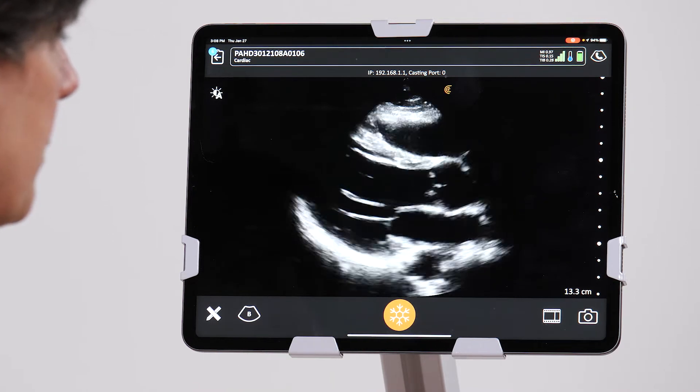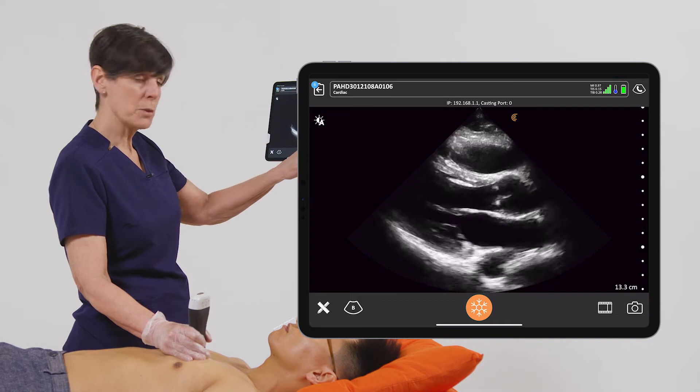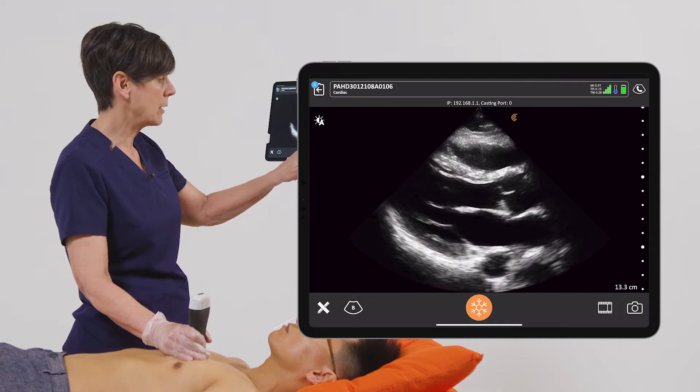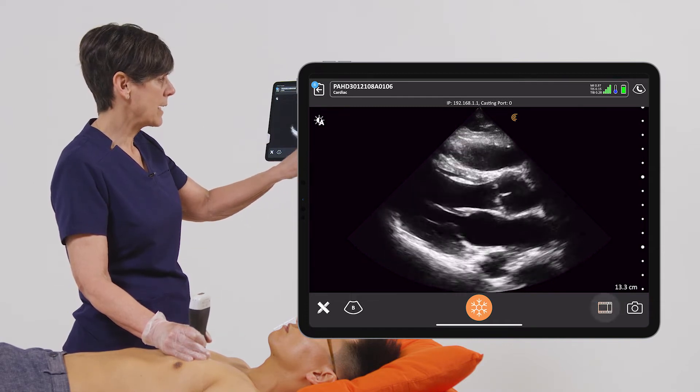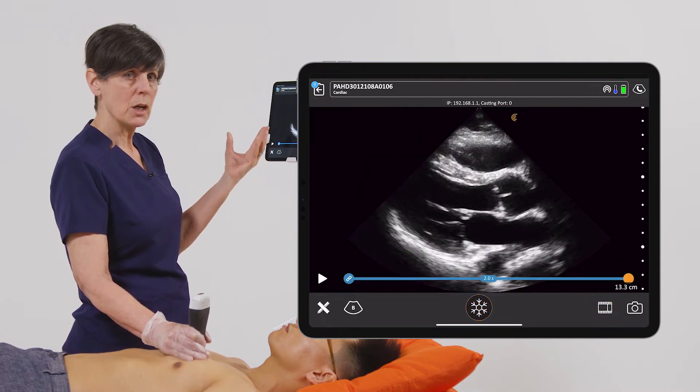I'm going to unfreeze my image and now I want to do a cine clip. There's a little film strip at the bottom beside the camera icon. If I tap on that, that's going to give us a couple of beats of cardiac rhythm.